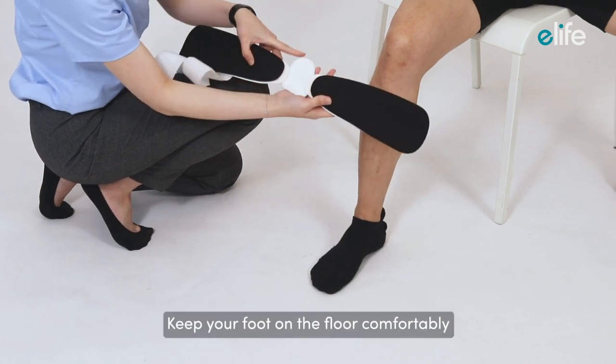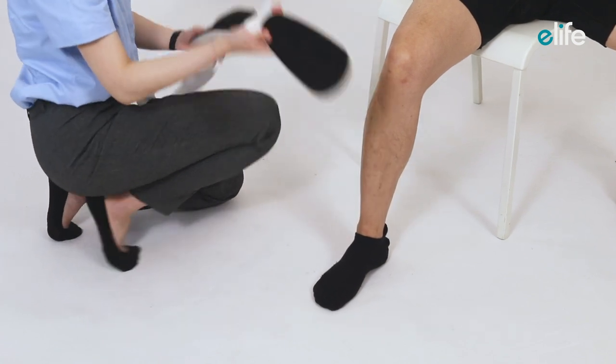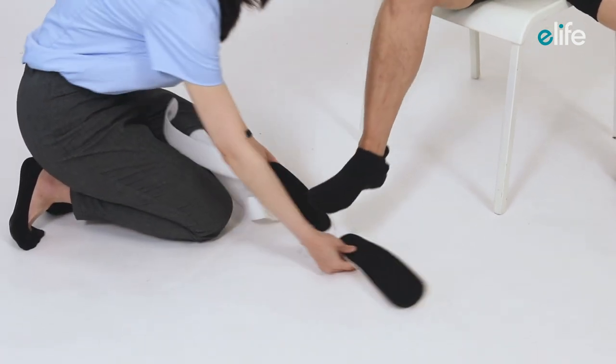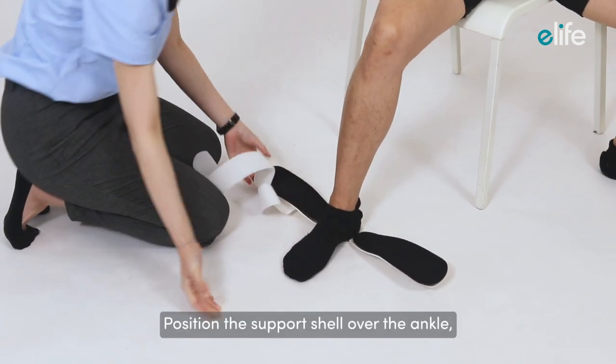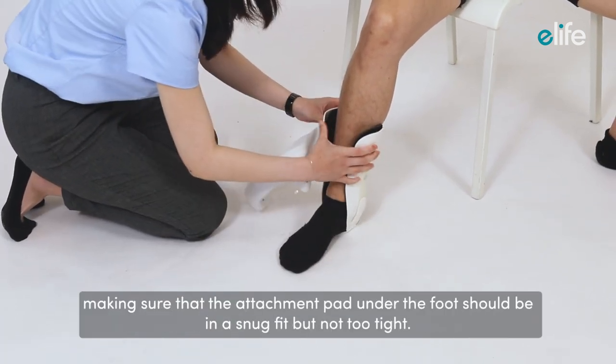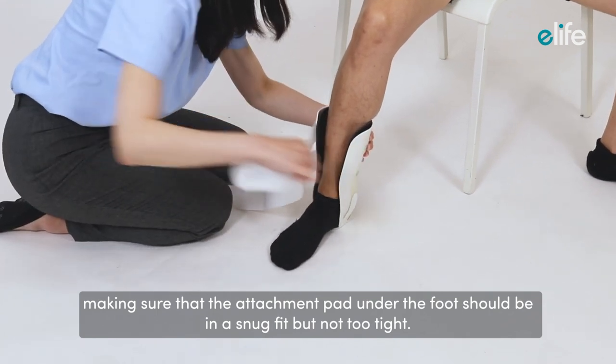Keep your foot on the floor comfortably and place your heel on the bottom of the stirrup ankle brace. Position the support shell over the ankle, making sure that the attachment pad under the foot should be in a snug fit, but not too tight.